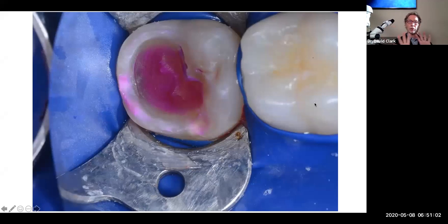So what we're going to do now differently than I did 10 years ago is we're going to go outside in. I'm going around and around and around. I did a flattened calla lily on the mesial cusps. I'm going to do a cuspal overlay on the mesial buccal and distal buccal cusps.